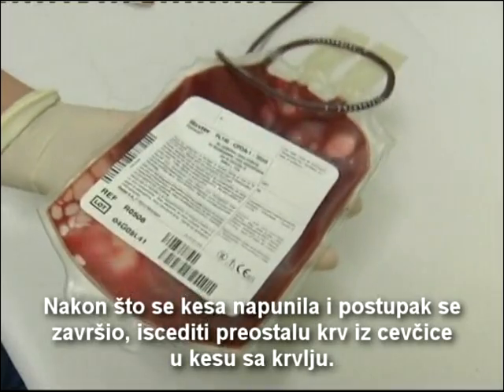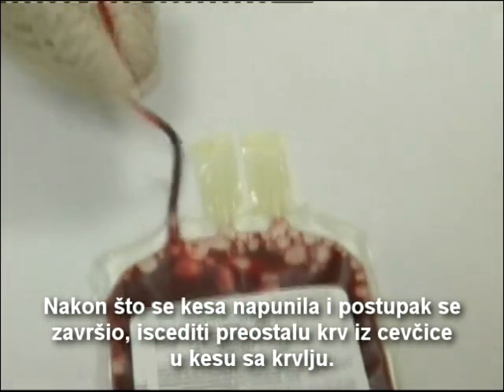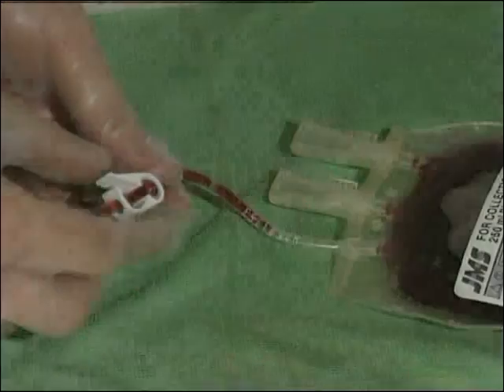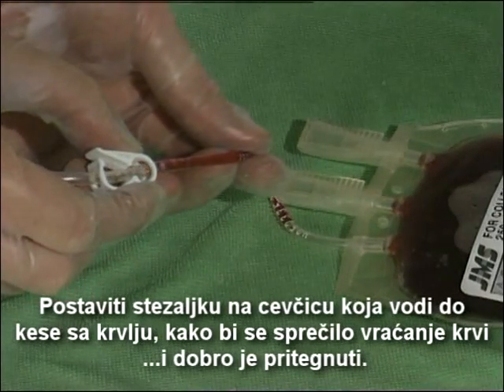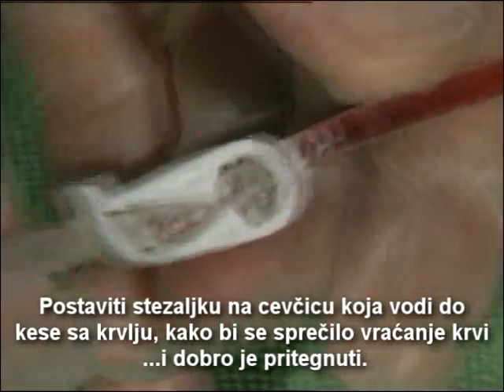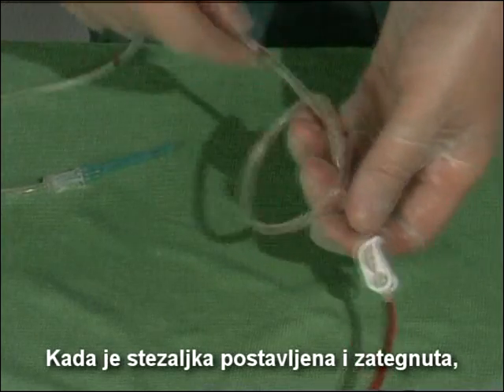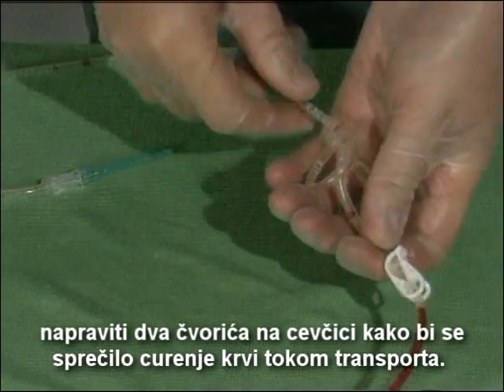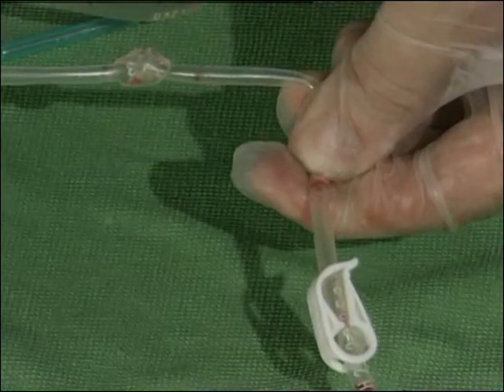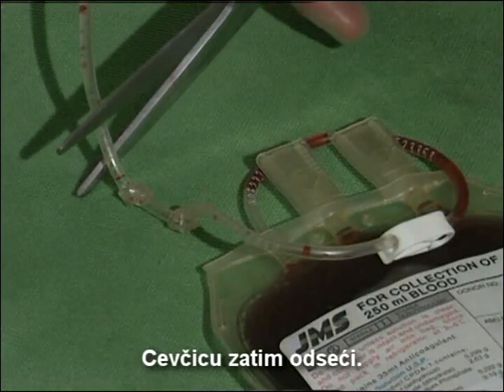After the collection bag is filled and the collection procedure stopped, squeeze the remaining blood from the tube into the blood bag. Apply a clamp on the collection bag tube to prevent return flow and close it tightly. Once the clamp is in place and closed, put two knots in the tube to prevent leakage during transport. The tube may then be cut.